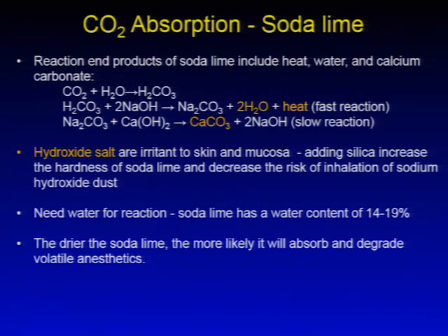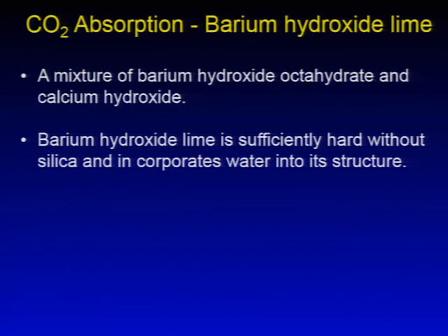Also, soda lime needs water for the reaction, as you can see in the top chemical reaction pathway. So the soda lime normally has a water content of 14 to 19%. If the soda lime is dried, it is more likely to absorb and degrade volatile anesthetic, which is relatively dangerous.